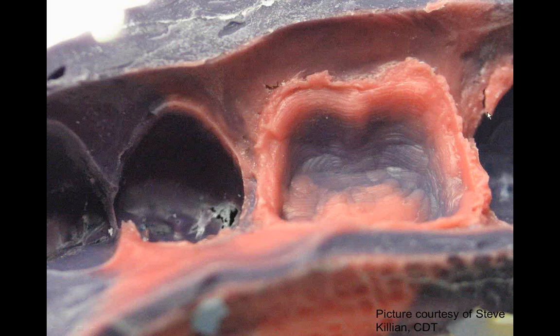capturing. First of all, you can see we've got a tear over here, which means that when you pour this up somewhere in this abutment tooth, we're going to have some problems. Now, that may or may not be an issue for you, but you need to be aware of it. Second of all, we've got these little kind of holes that appear in the impression material here in the wash. But if you look over here, you can see them also in this abutment tooth on the occlusal surface. So it's something that we need to be aware of.